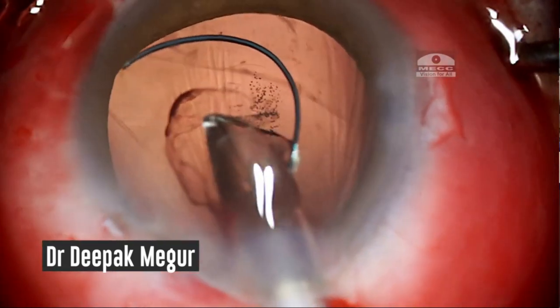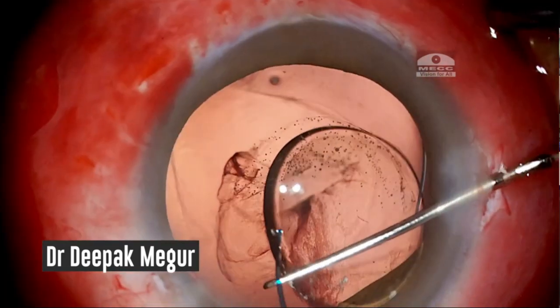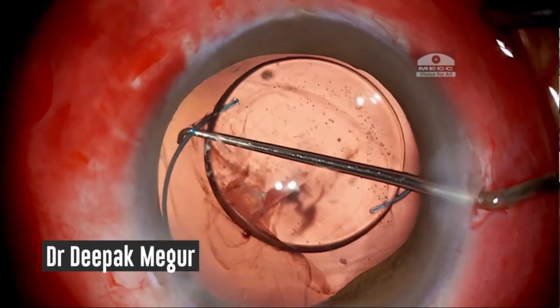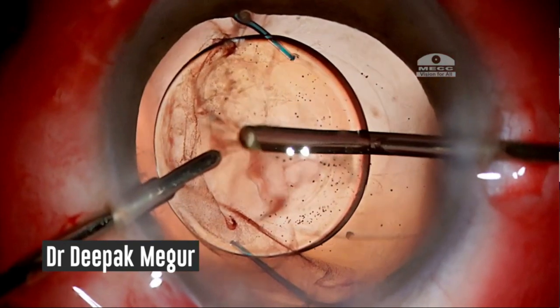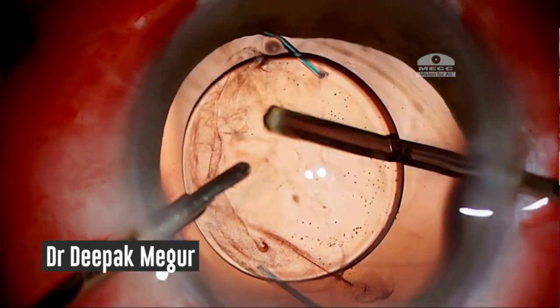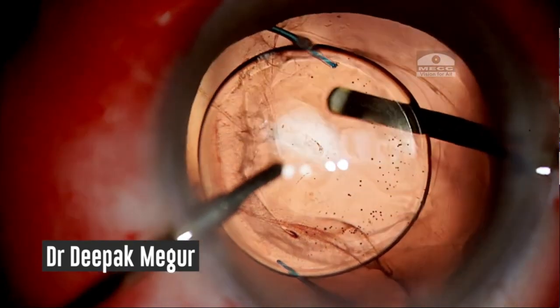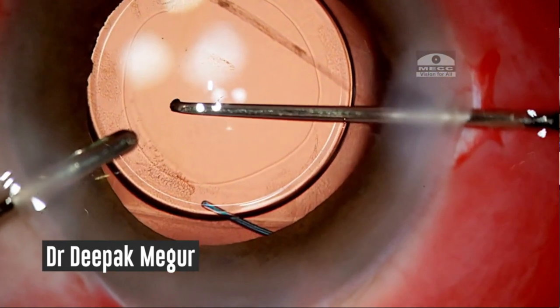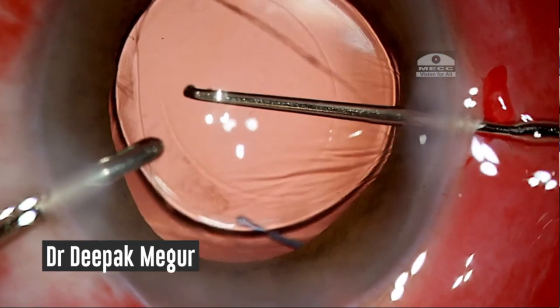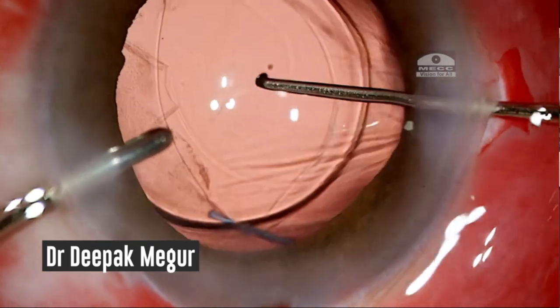After just doing a limited anterior vitrectomy, clearing off a little bit of the lens debris which was there, the plan is to put a multi-piece lens into the sulcus. This is a hydrophobic acrylic multi-piece lens I'm placing into the sulcus. The lens is then gently dialed. Now I go again with my vitrector to remove the OVD which has gone behind the lens into the vitreous cavity.